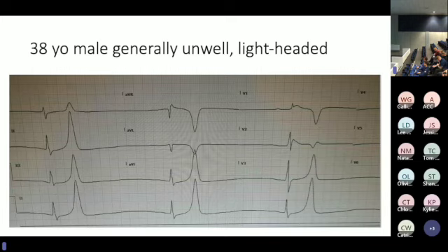Spot diagnosis. Yeah, so this was a patient who presented to RPA who missed their dialysis, who was sat in a chair because there were no monitored beds available. Renal were consulted and they just took him straight to dialysis without any monitoring, and he did well.